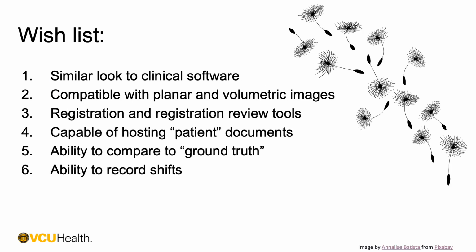For this platform to be effective, we needed to have a similar look to current clinical software. We also needed to be able to handle planar and volumetric images so residents can practice registering both radiographs and cone beam CTs. We wanted to have the same registration and registration review tools that residents would encounter in the clinic. And we also wanted to be able to host patient documents. So if they decide that in order to assess if a registration is correct, they need to know more about the plan, they have all the information that they need within our software.